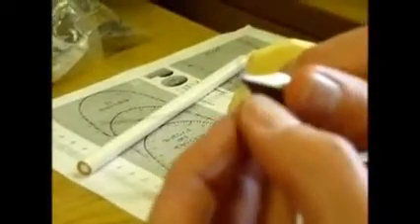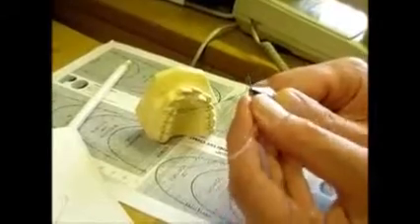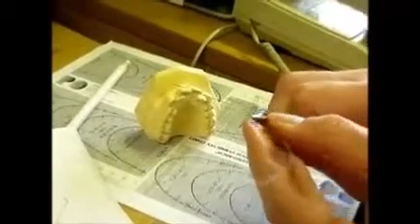Yeah. And so you've got to try and get this one as near the right height as possible. I'll just do it against the white because I can't see against the table with all those lines on it. Now you've got to make sure that the thickness of the wire is accounted for, so you put the side of the plier here roughly level to that side of the wire, not this side of the wire, otherwise you make it a bit too long. And then you've got to put your bend in here so that you get them roughly the same. Now it doesn't matter if they're slightly out in height. You've got to get your right angle bend spot on, and then it might need some adjustment at this stage to get the wire level so that it all sits on the table. So you want to try and get it roughly so that it's flat on the table again.